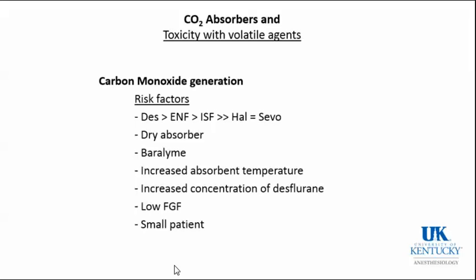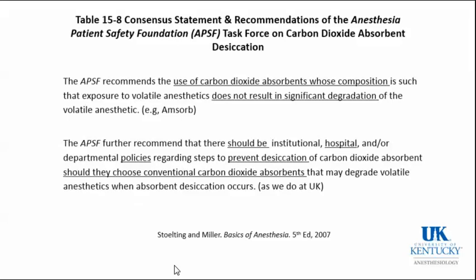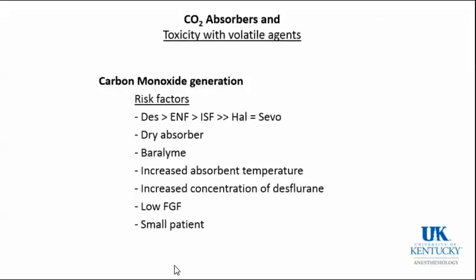That has been eliminated by making sure oxygen is always turned off. So in the morning, especially every day, but especially on Monday, if you find that the oxygen is still on, you should request that the soda lime be replaced with new agent, which I guess I didn't mention, but at UK we use soda lime because it's cheap and we're cheap, but for this reason it's very important that the soda lime be changed regularly, and I think they have a good policy for this.